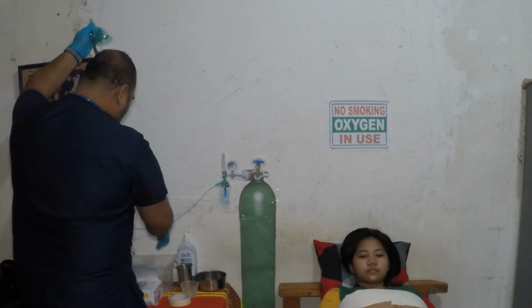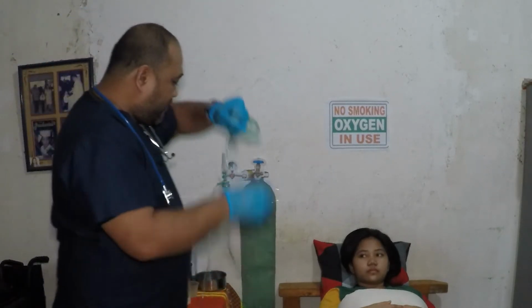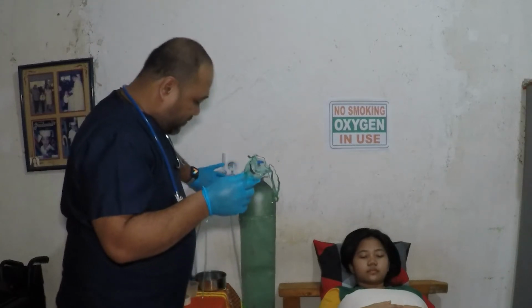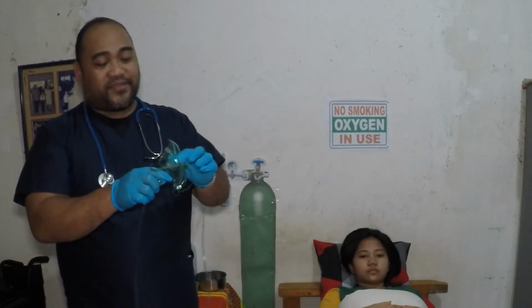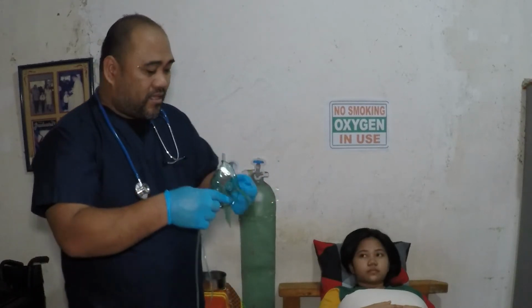As what I have mentioned, they have the same procedure except for the type of the mask. So now we'll be using the simple face mask. This is how we will do it.